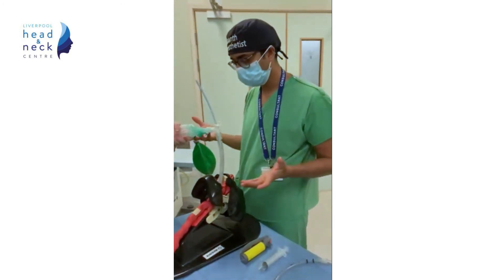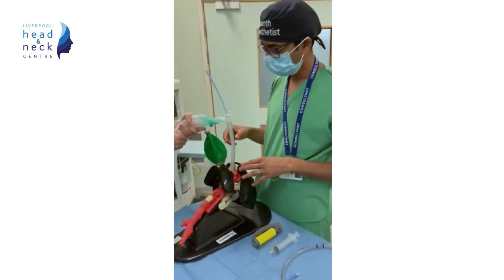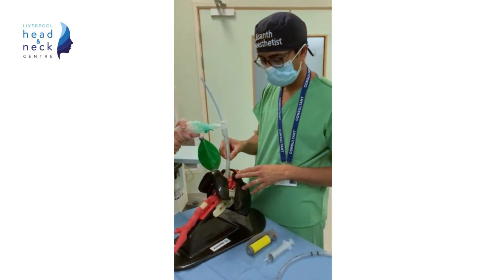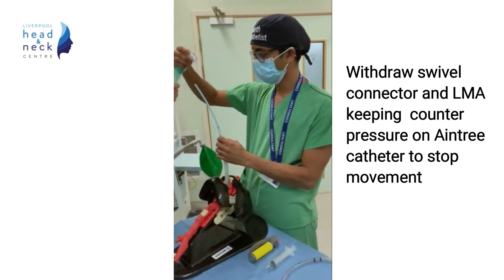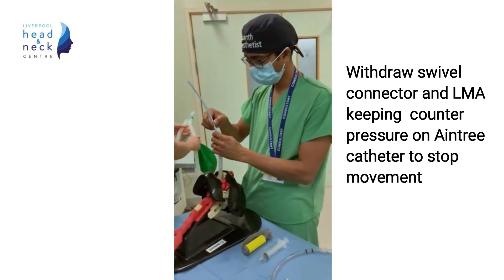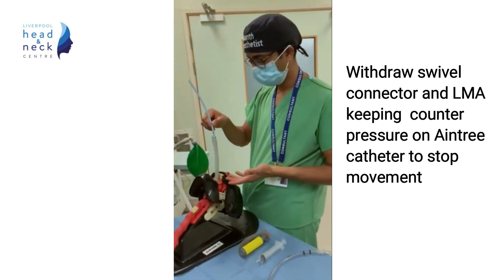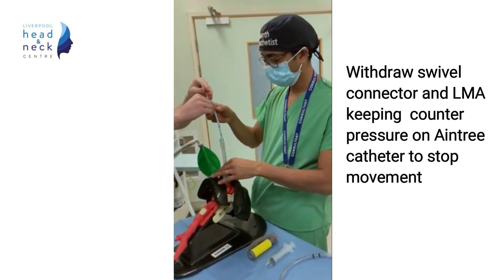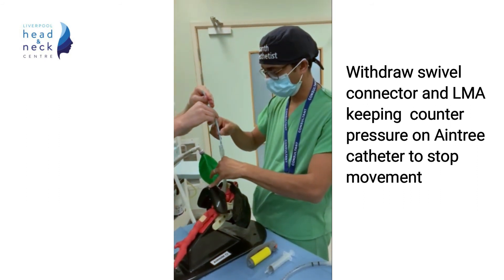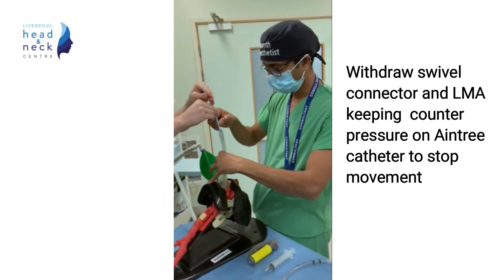We then remove the swivel connector and then the LMA. Try not to dislodge the Aintree catheter. Some counter pressure from an assistant and grasping the Aintree catheter in the mouth helps keep it in place.